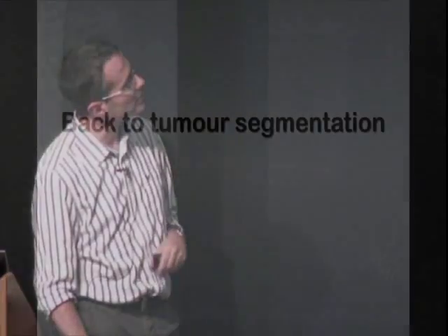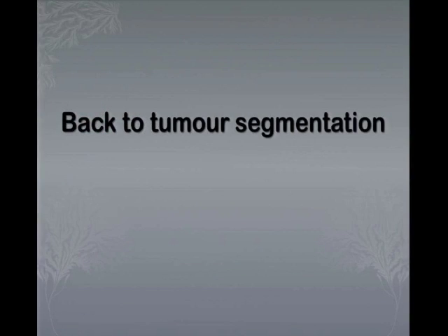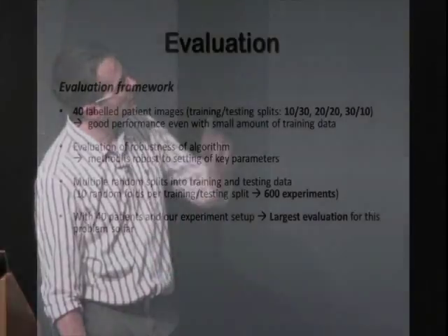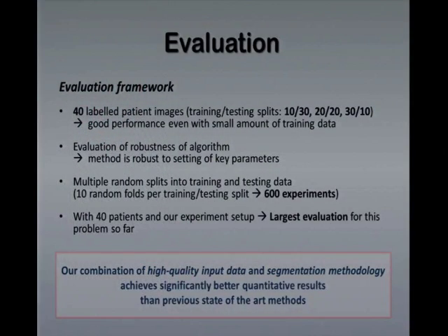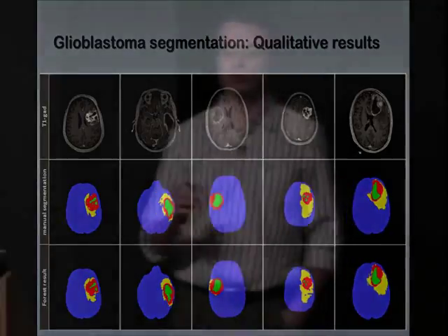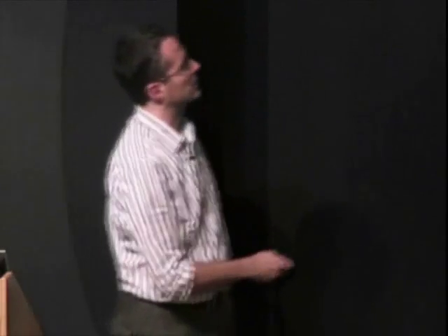More examples. But okay, so that's the underlying theory of what happens behind the scenes, both in the Kinect world and in the medical world. But going back to the brain tumor problem, which is our application. Right, forget all this. These are the results that we get. So for each column here, you have a different patient. These are all test patients, which means that they have never been seen before by my computer, by my algorithm.